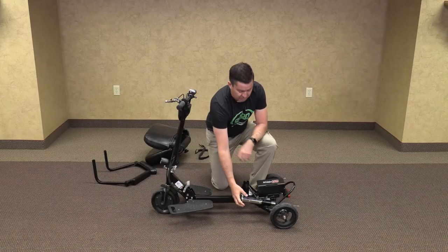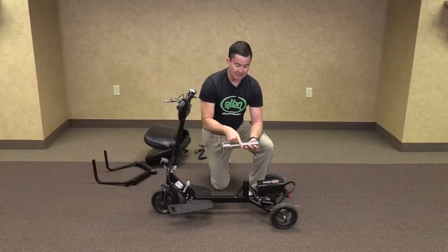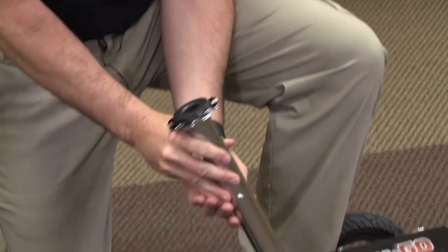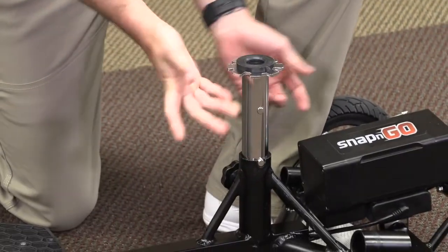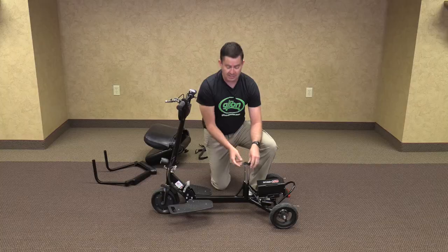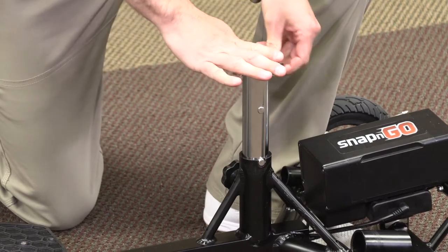Now we will install the seat post. Remove it from its travel location. We are going to make sure that the pegs on the side fit nicely into these locations. It slides in, which keeps it from rotating. If you're not sure if it's in — if it can twist, it's not in the right place. Twist until it locks in place.